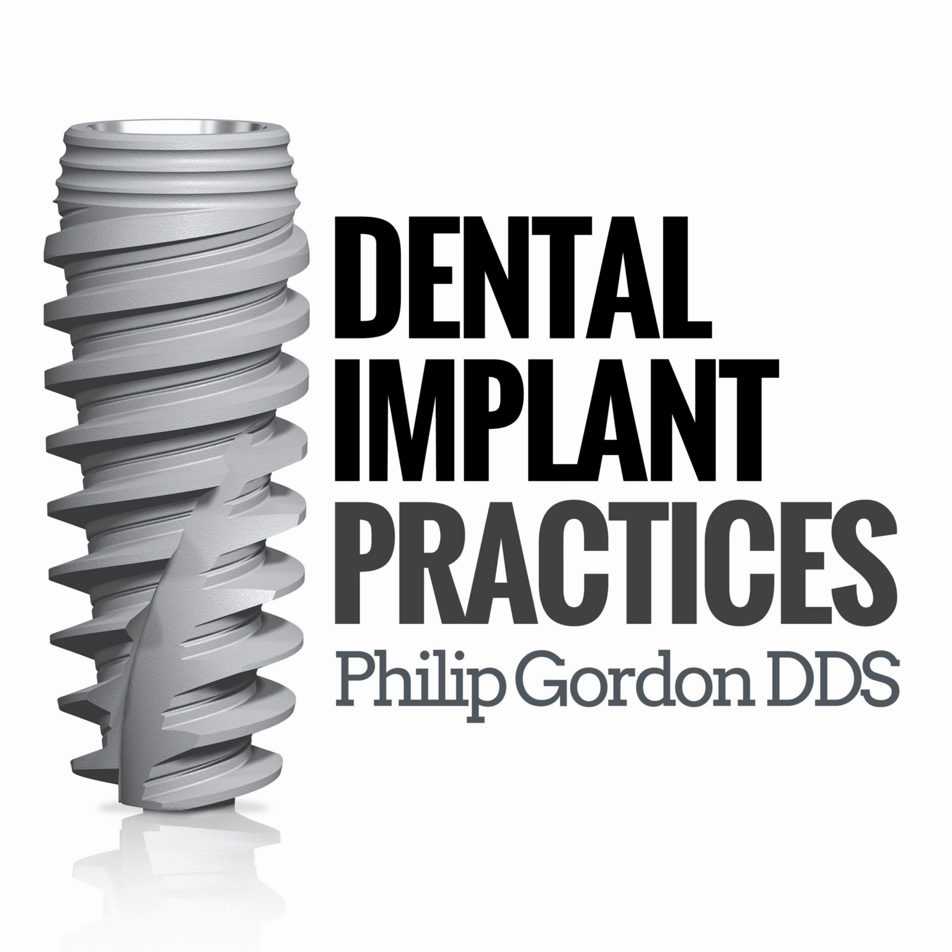So this is your crash course guide on single implant placement. These processes and protocols are slightly different per implant system, so I would encourage you to check with your implant manufacturer or the literature based on certain levels of bone preparation and torque settings. They each have their own specific category, but most of them fall within a compatibility chart. So sometimes just checking those can be enough.